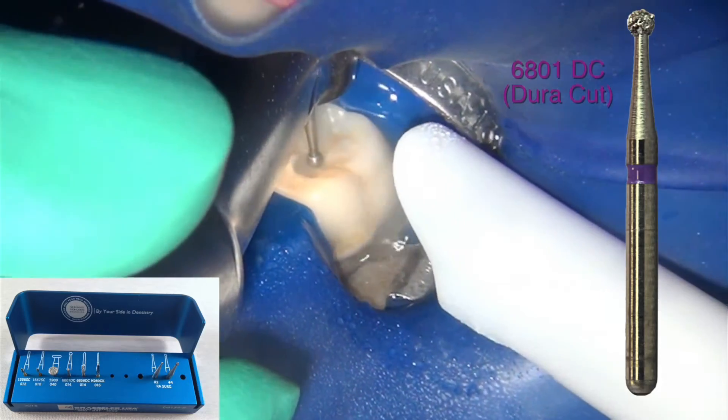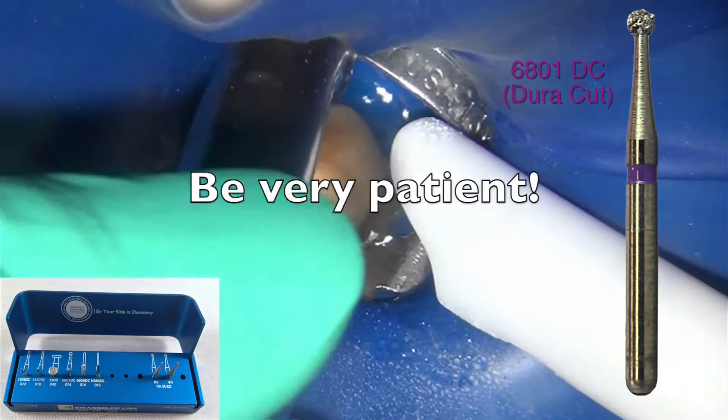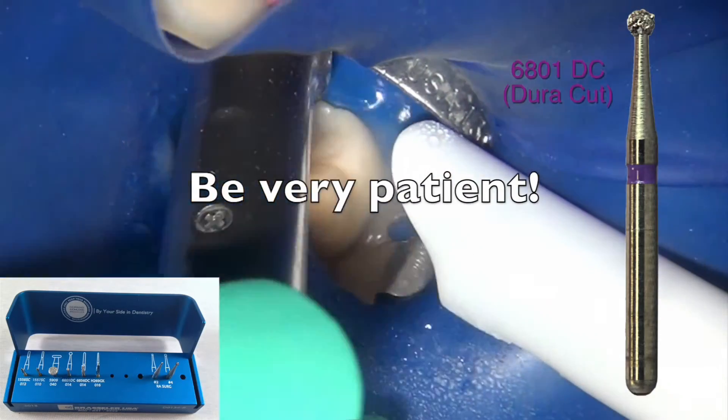As you can see here, I'm doing my access preparation with a very light touch and using a copious amount of water.